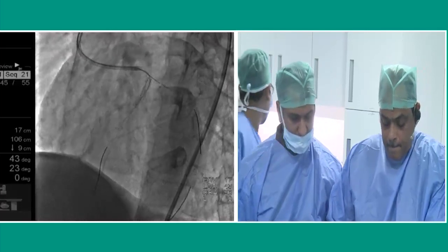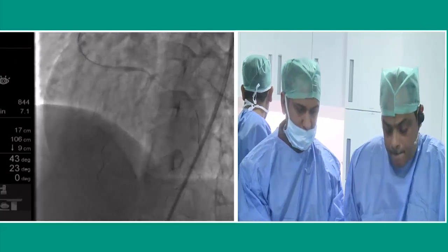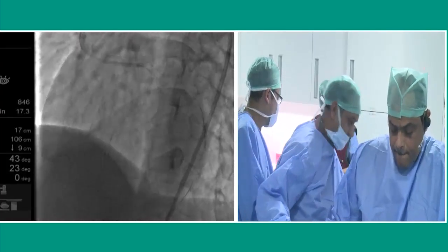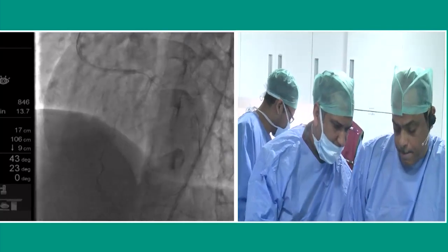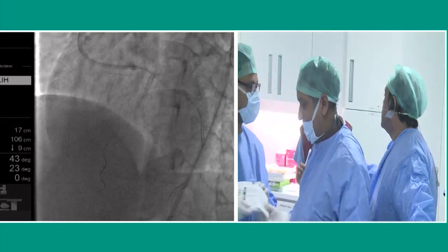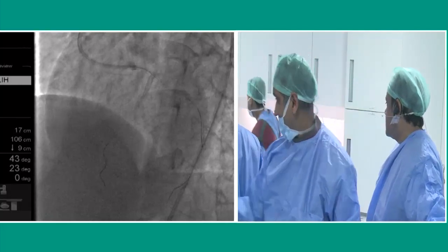Is it because of the design of the stent? It's the stent design. The BioMime, it's either the first row or the first two rows, if I remember correctly, are closed cell. Every cell is joined, and then you only get the open cell further down. And you have to break that cell, otherwise there's no way you're going to open it up.